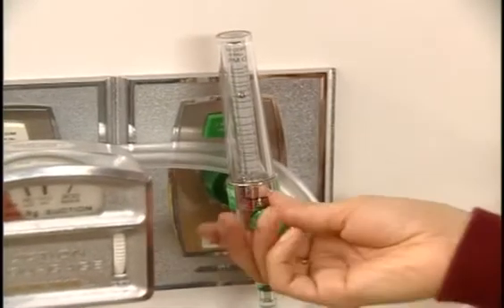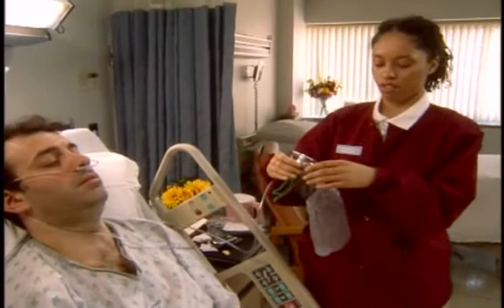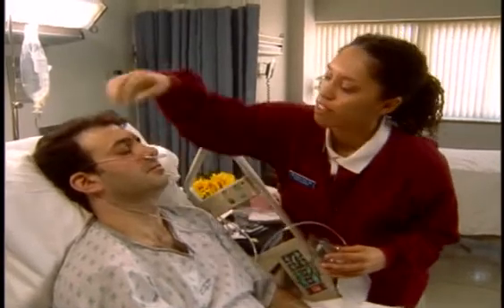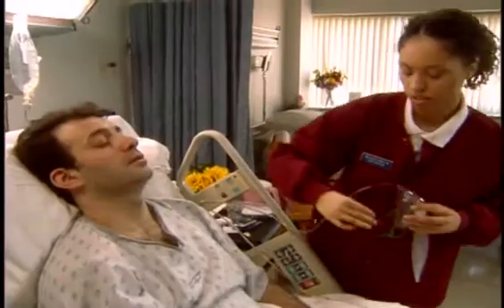Once you've adjusted the flow rate to the ordered amount, be sure to let the bag fill up with oxygen prior to placing the mask on the patient. Right, of course. Okay, I'm gonna put the mask on you now, Mr. Simon, okay? We're just gonna take these out. Lay that here. Put this on you.